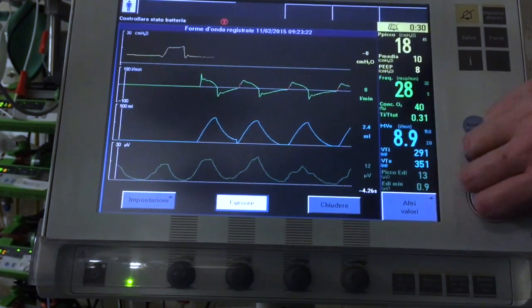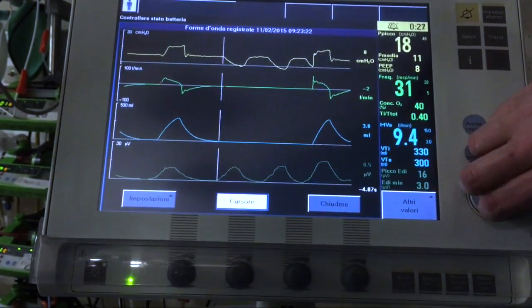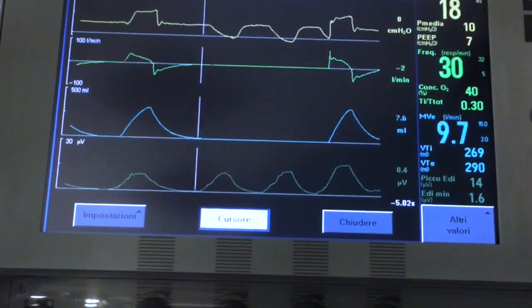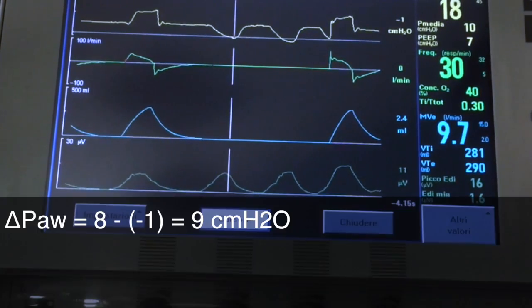We go back and take the airway pressure value at the beginning of an effort and add the minimum value, from which we obtain the total pressure swing, 9 cm of water in this case.